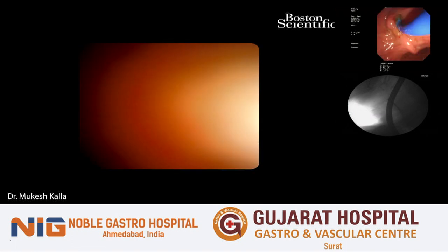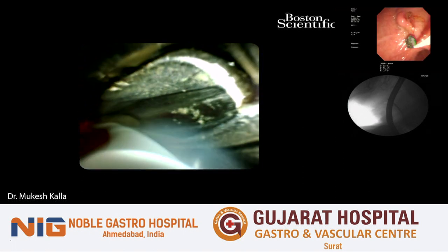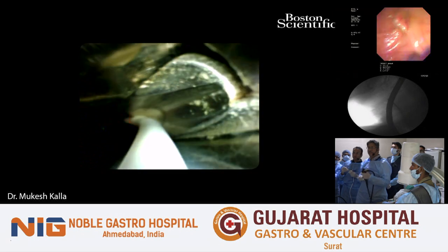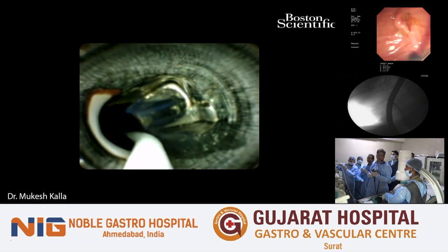I am not sure whether you people have seen the lower CBD. Have you seen the lower CBD? So that's the stone. Sometimes patient relatives ask where the stone is, so you can show them.